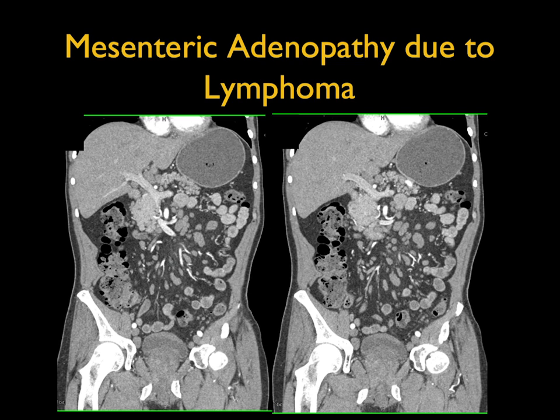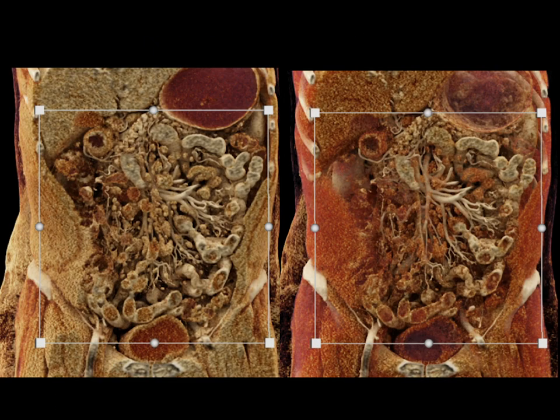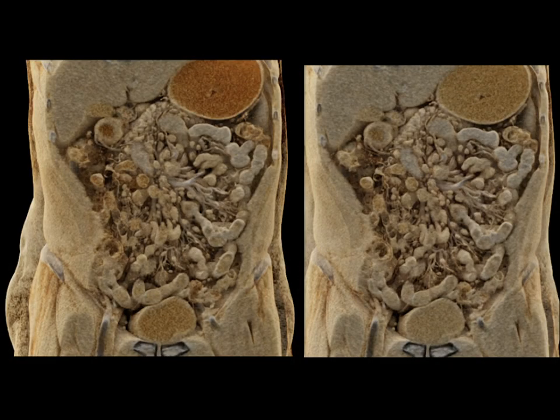Another example: mesenteric adenopathy in a patient with lymphoma. Look at the detail of the small bowel and the mesenteric nodes, nicely shown here. I'll change the rendering just a bit — look at the details. The vessels are stretched, slightly displaced, but look at all of the mesenteric nodes that you're seeing. A really nice example.